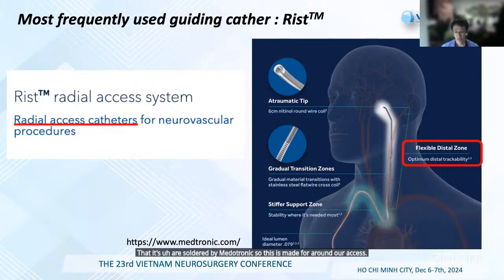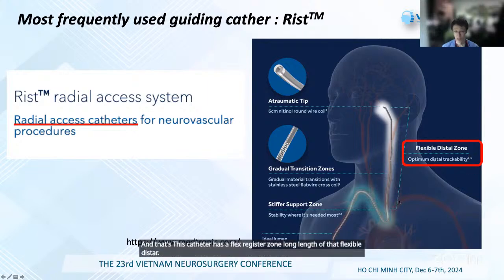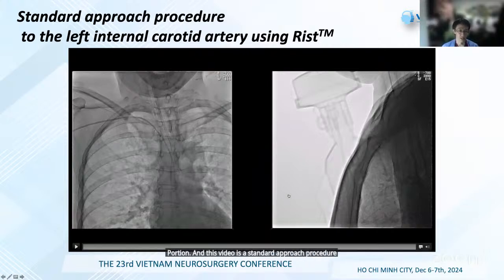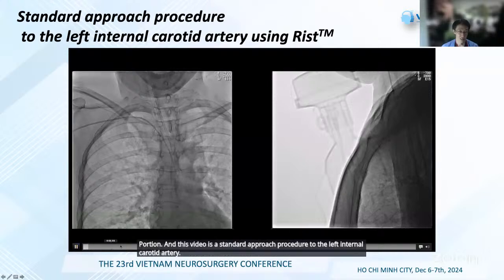This catheter has a flexible distal zone, a long length of flexible distal portion. And this video is a standard approach procedure to the left internal carotid artery.